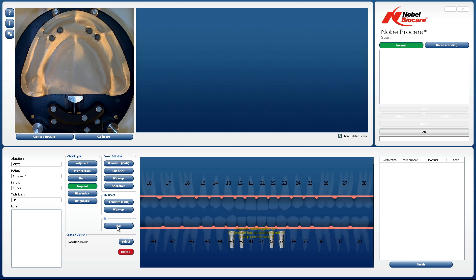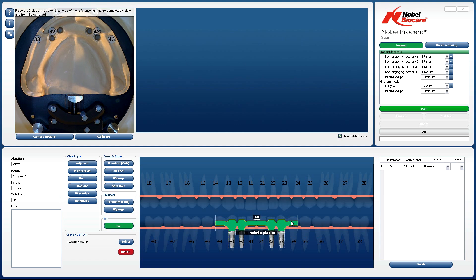Left-click on Bar. Left-click on the tooth posterior to the first implant on the tooth chart. While holding the left mouse button down, drag the bar through to the tooth in the posterior position of the last implant. Releasing the left mouse button at this point will place a bar in the tooth chart over the top of the implants.